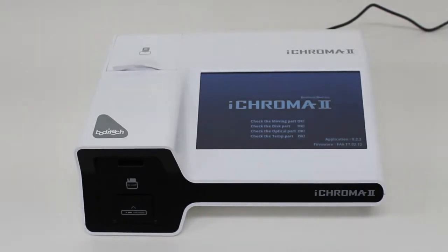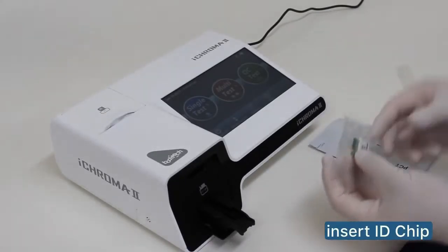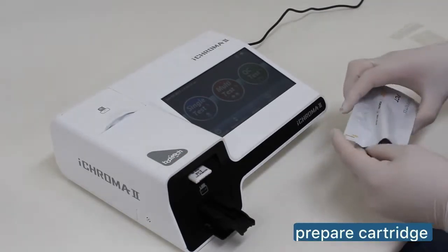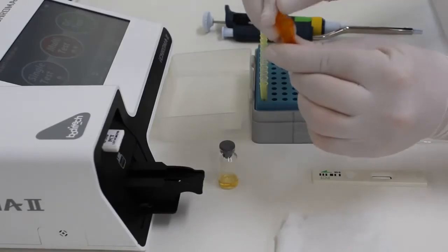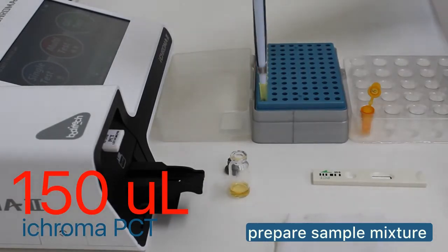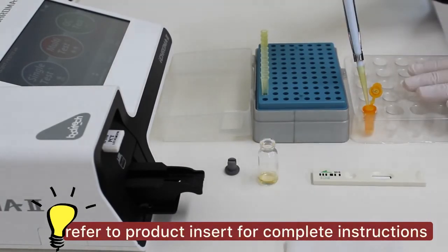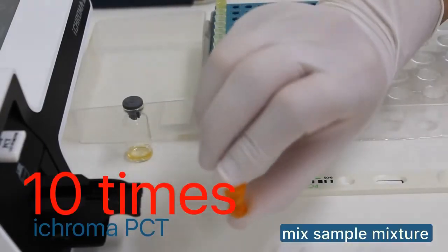You should see the main screen after. Insert the ID chip into the ID chip port. Prepare the cartridge for testing. Transfer 150 µL of the sample using a pipette into the detection buffer tube.